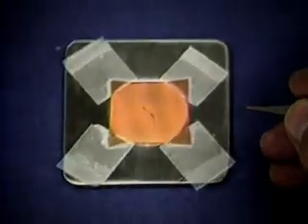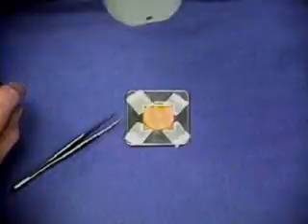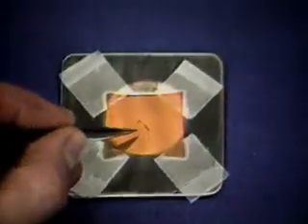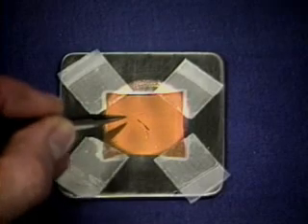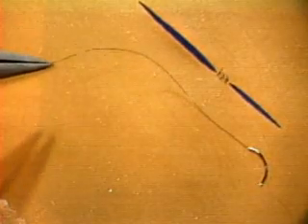Now that we've seen what's important, let's see how to pick the needle up just right. There's a way that works every time. Resist the urge to go after the needle with the right-hand instrument. Instead, start with the left-hand instrument and use it to pick up not the needle, but the thread. Pick it up here, about 2 centimeters from the needle.